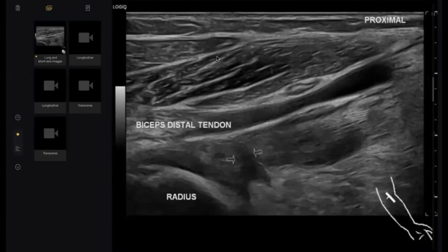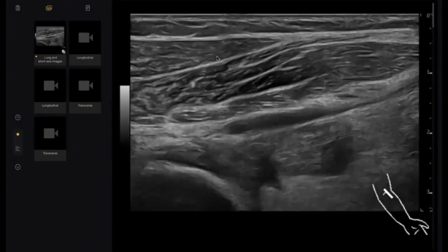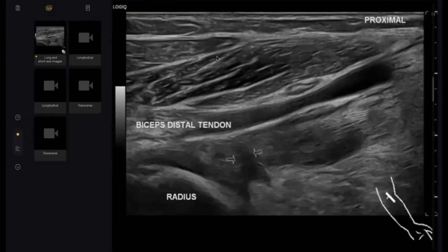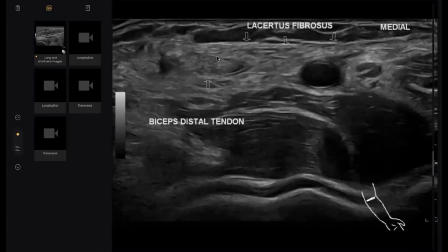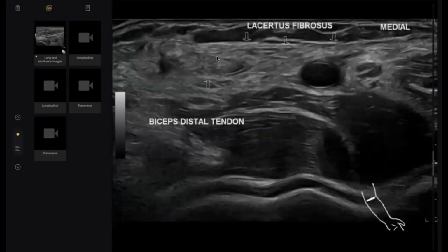Overlying subcutaneous soft tissue and skin thickening is normal. So it's a complete tear of biceps tendon with fluid in its canal. Next, I would advise MR to the patient for further confirmation of my findings.